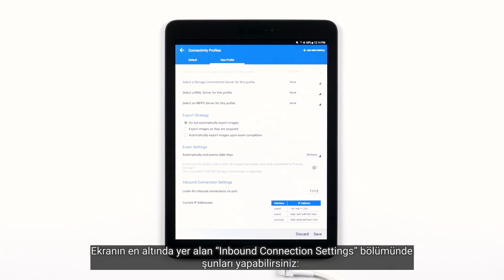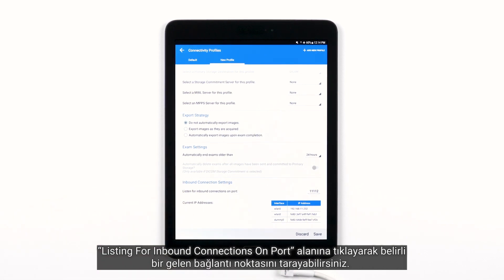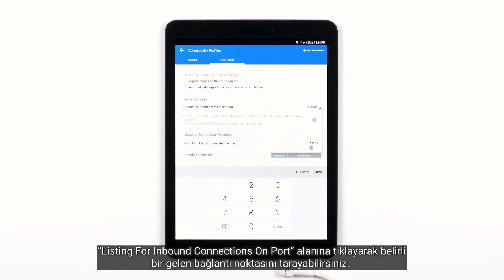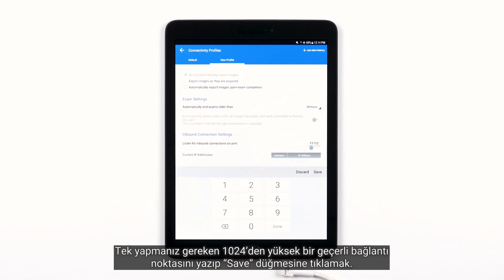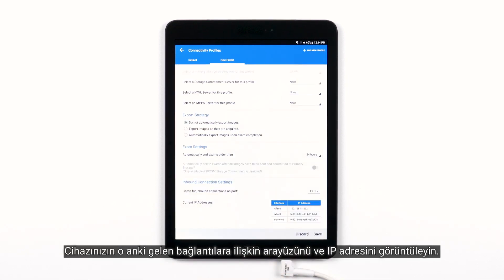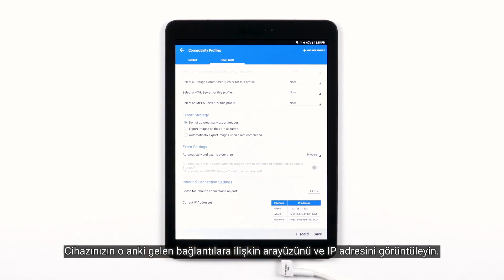At the very bottom in the inbound connection settings, you can scan for a specific inbound port by tapping the Listen for inbound connections on port field. Just type a valid port higher than 1024 and then touch Save. You can also view the interface and IP address of your device's current inbound connections.